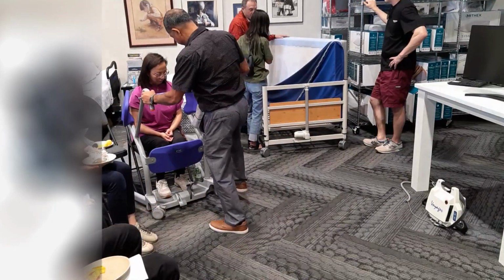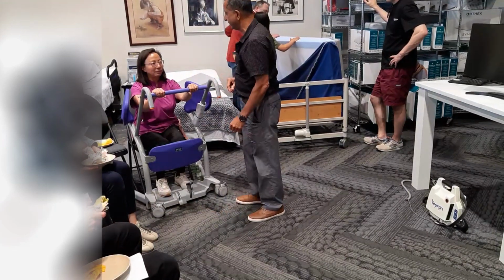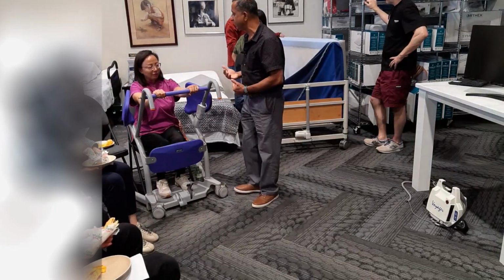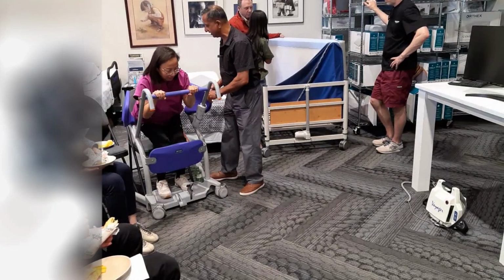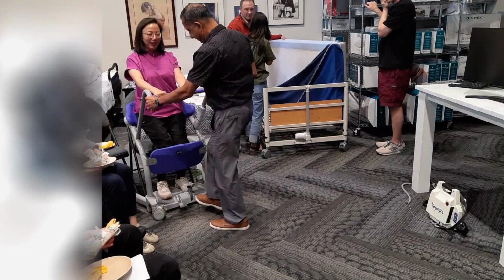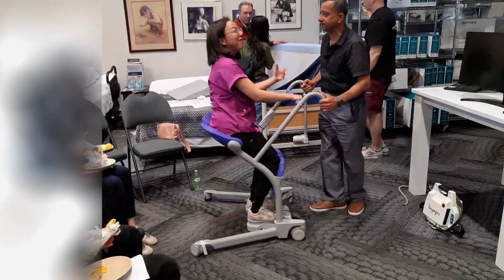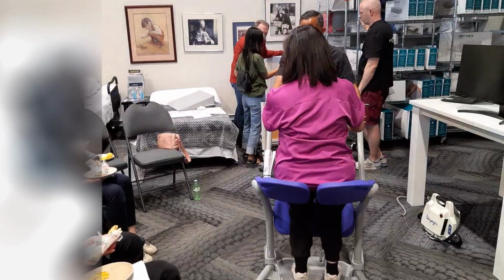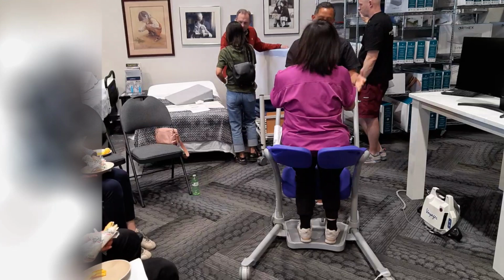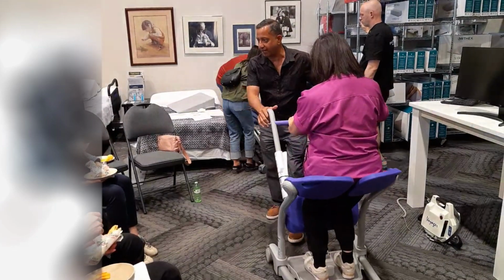Once we are here, I'll put the brakes on and ask Barb to grab this handle. Because Barb still has a lot of strength, she can still stand up, but she is not stable. So I'll prompt Barb to stand up. Once she is up, I'll put these pedals back in place. Now I can unlock it and transport you. I feel like I'm in a shopping cart. Point A to point B. It's the other way around, like a baby again. Yeah, there you go. So that's the basic concept with this particular device.